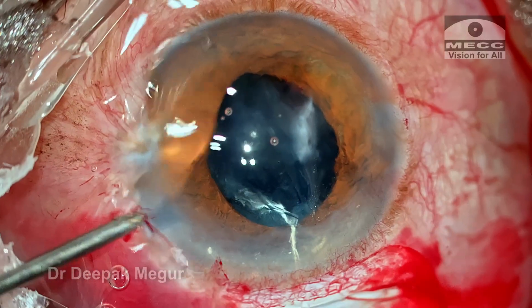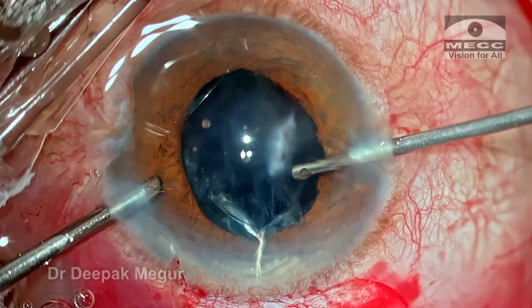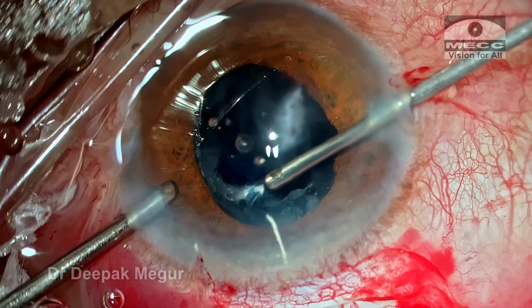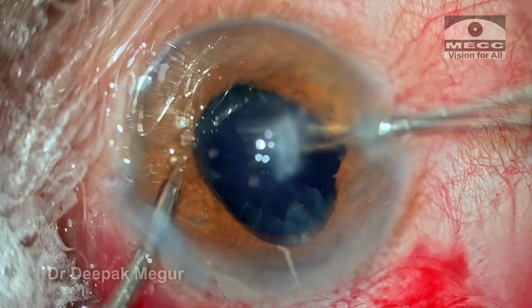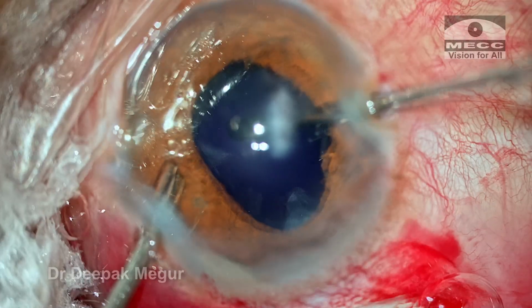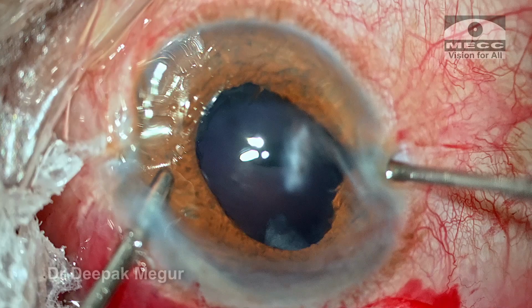So time to begin the vitrectomy. The sclerocorneal tunnel is a self-sealing incision, so that's one good thing. I don't have to suture it. So I'm going to use the 2 side ports, one for the irrigation and one for the cutter to do my anterior vitrectomy. So the cutter goes in and the anterior vitrectomy is done. It takes a while for me to do the anterior vitrectomy, maybe about 7 minutes.